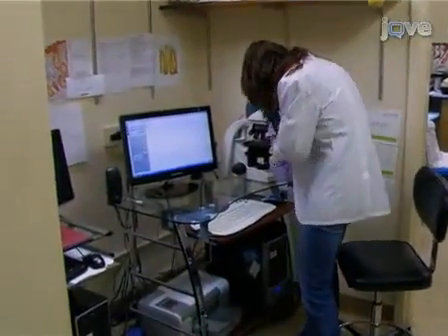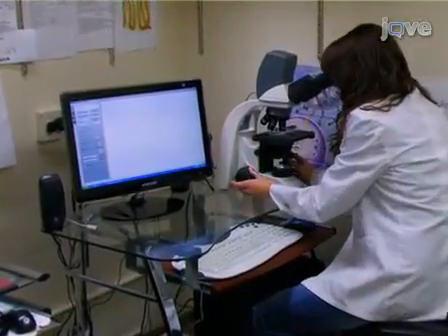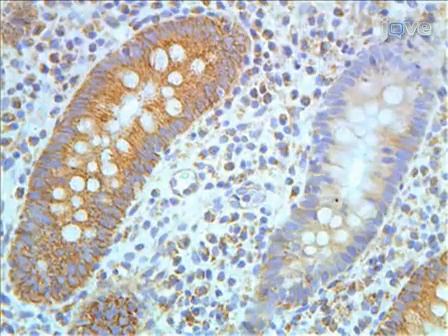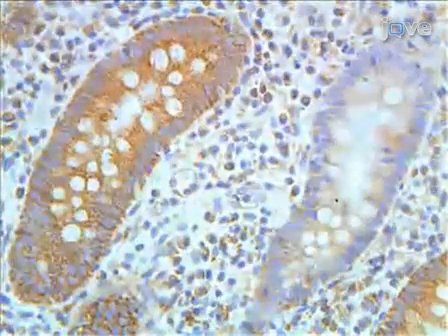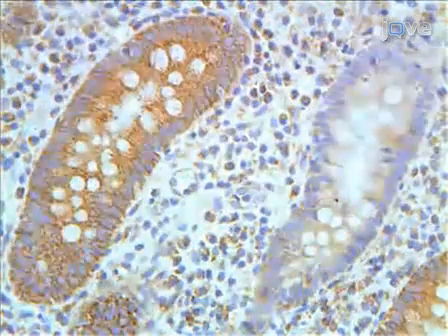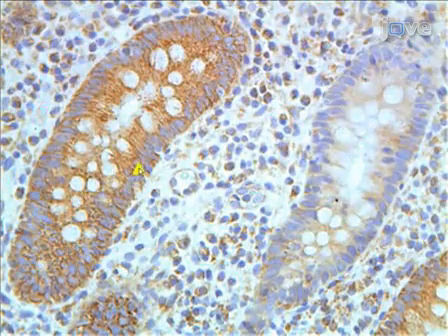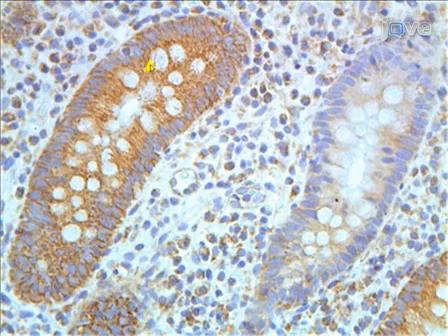Next, Nadia Hasuna will examine a stained tissue section for expression of CcOI in crypts of colonic mucosa. We can go through a tissue section immunostained for cytochrome C oxidase 1, or CcOI, using a 40x objective. CcOI is a cytoplasmic protein and is not expressed in the nuclei, which is why the nuclei have stained only blue. CcOI is expressed in the cytoplasm, shown with the brown staining.